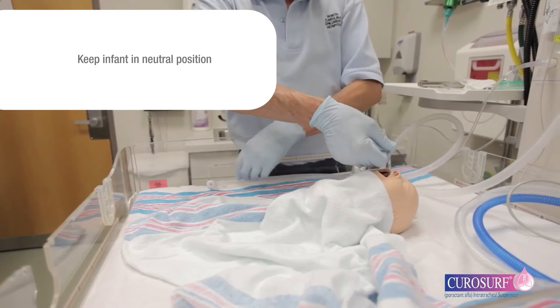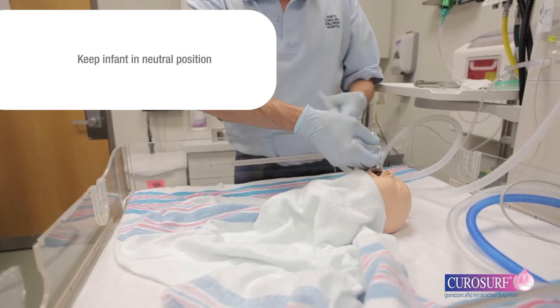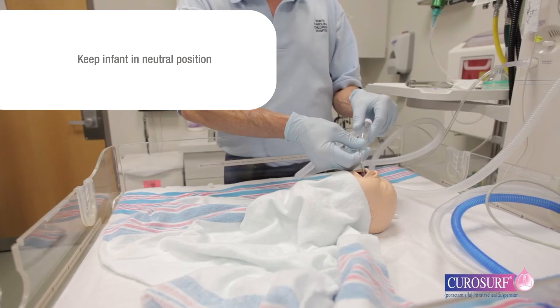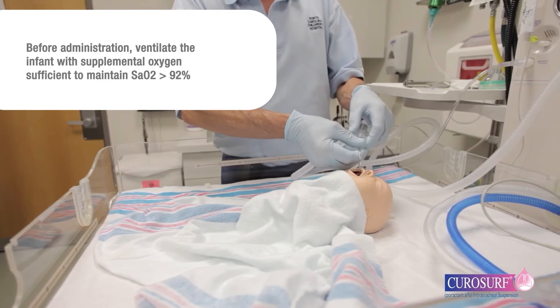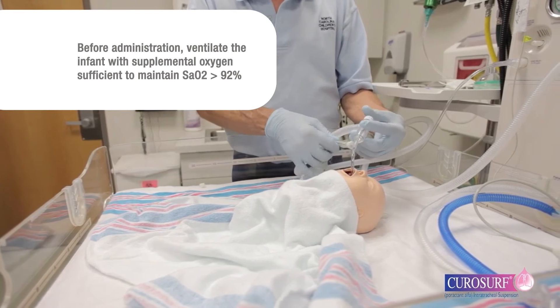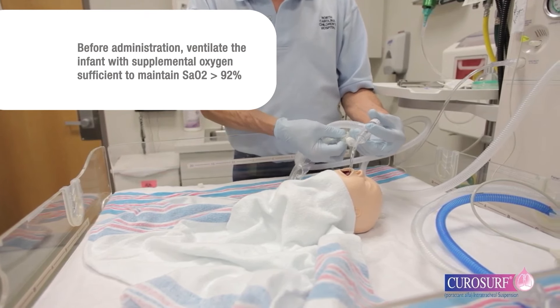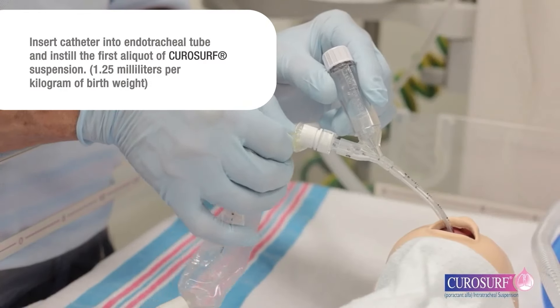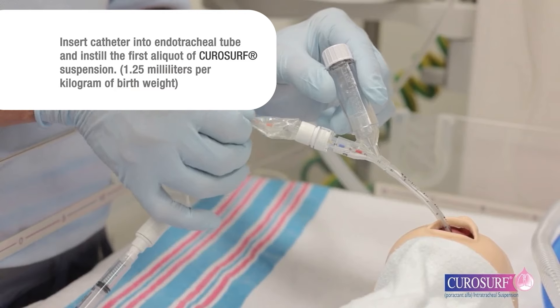Keep the infant in a neutral position with head and body in alignment without inclination with either the right or left side dependent. Immediately before CuroSurf administration, ventilate the infant with supplemental oxygen sufficient to maintain SAO2 greater than 92 percent.